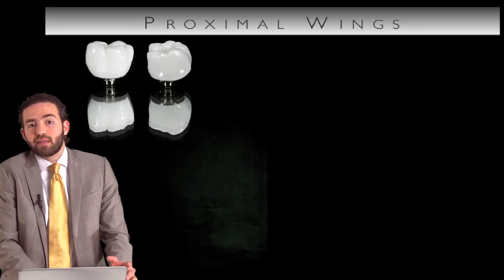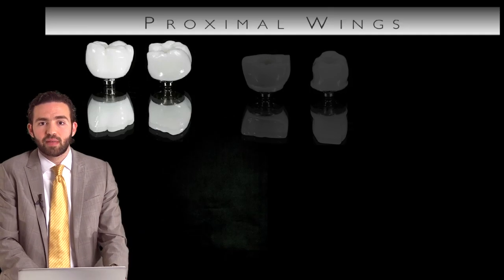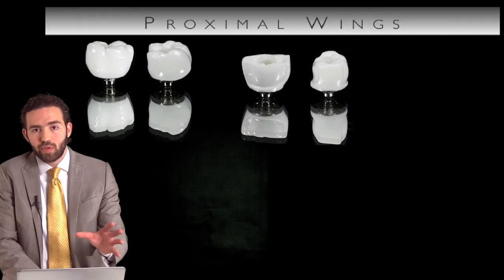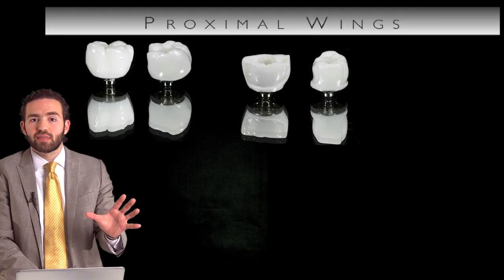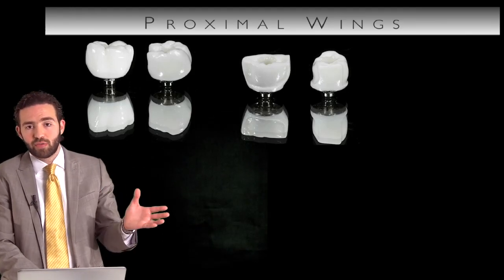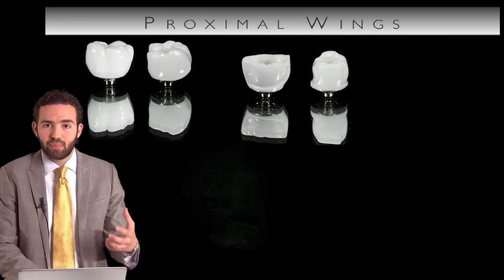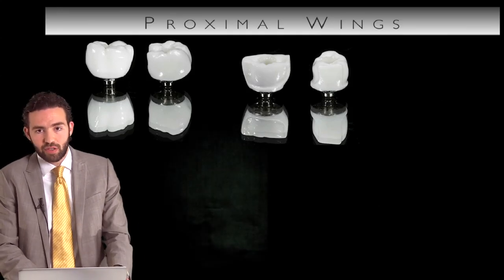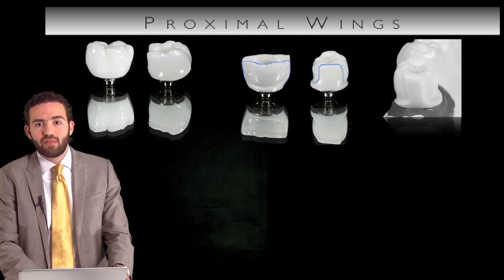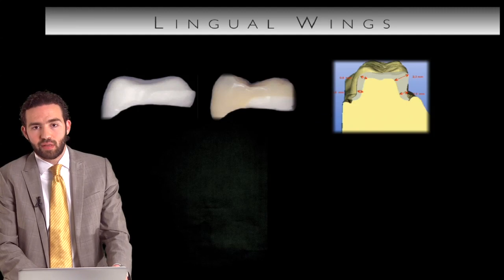Number one is provide proximal wings. After you make your full contour wax up, when you cut it back and when you provide your framework design, keep those mesial and distal parts of your restorations in zirconia. So that provides as best support as possible for the veneering structure. Let's have a look at the outline and how that gives good support for the occlusal load.